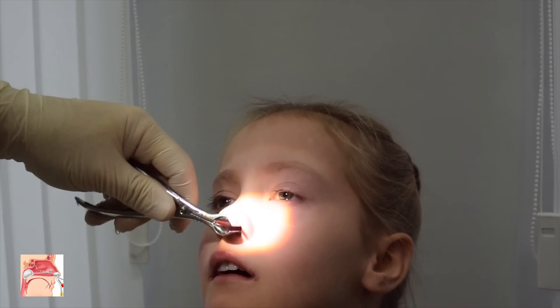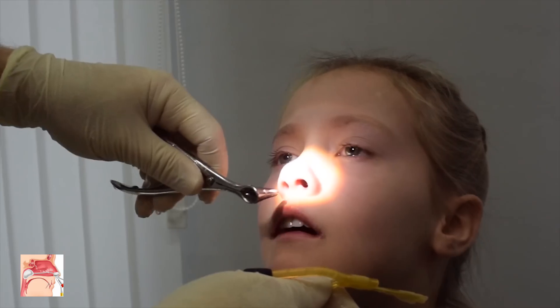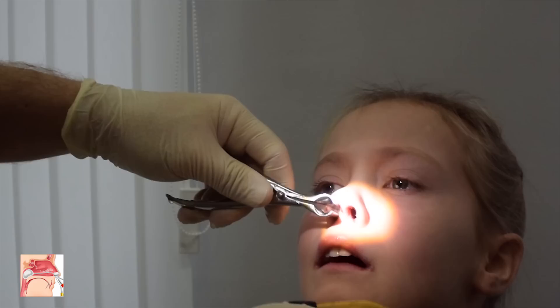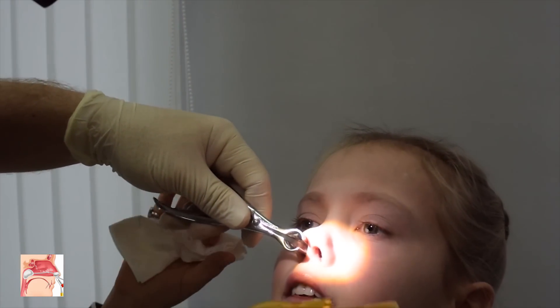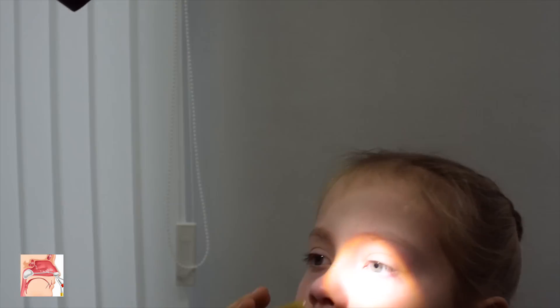A similar procedure should then be performed for the right side of the nose.